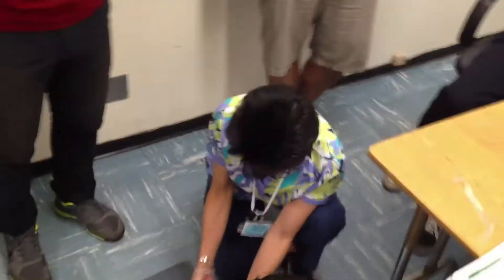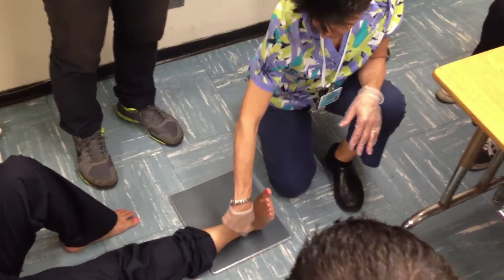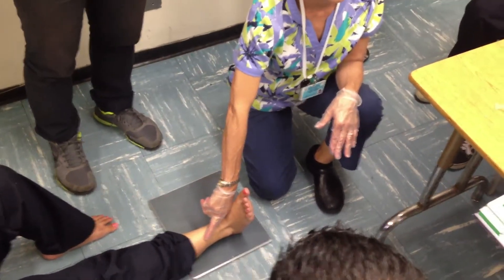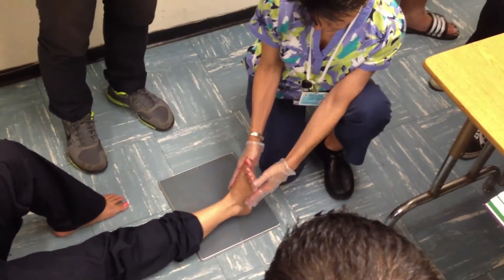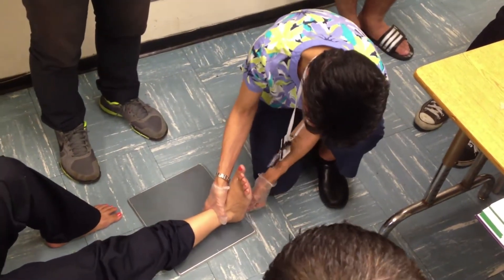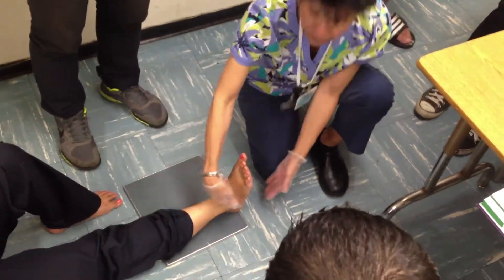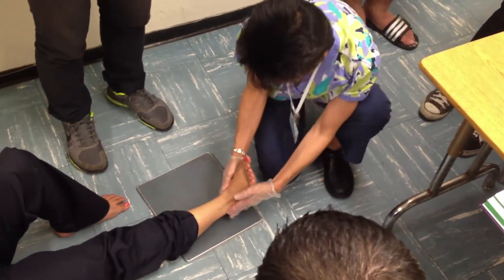Now we're going to do ankle. Dorsiflex — just AP. Don't allow her to favor a side. This is going to put both — this is the tibia, this is the fibula — they're going to be superimposed. I have plenty of films to show you that the foot is favoring a side. You can't have it favor a side. Here's my AP — you don't want to do this because the beam is going to project it out. So you want to give yourself a few inches.